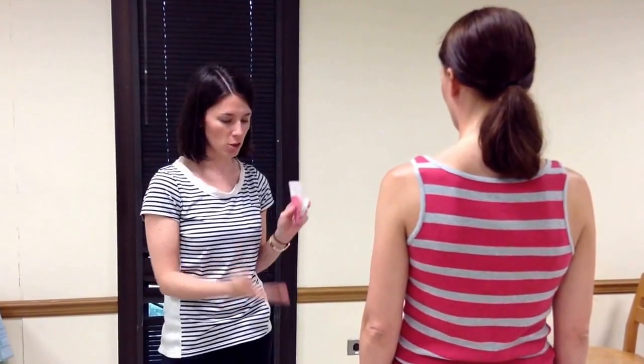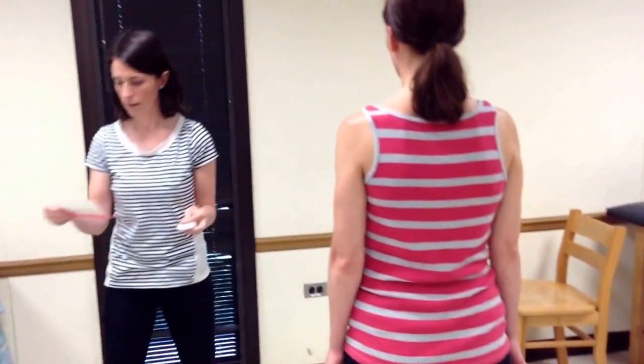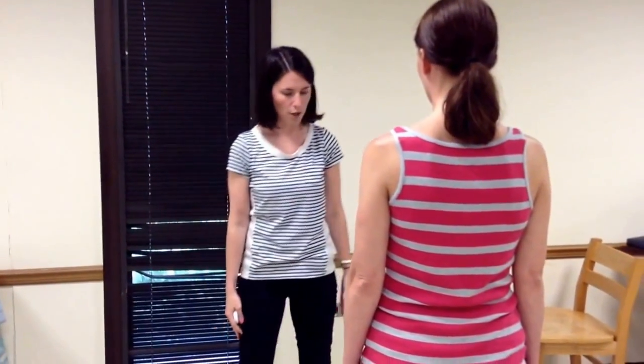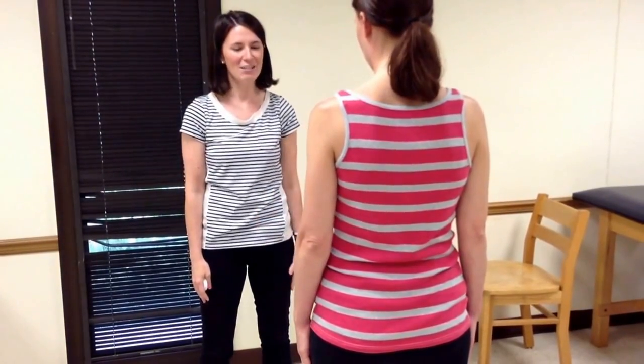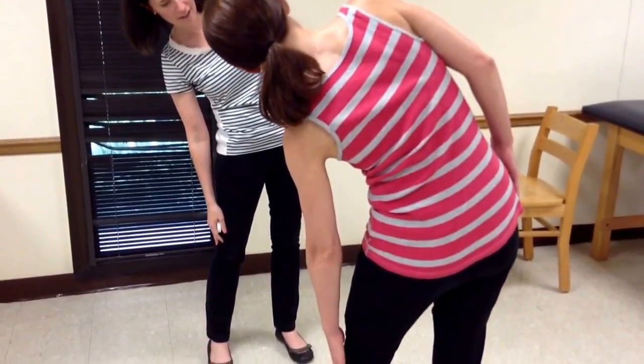The patient should be standing with her shoes off, her feet shoulder width apart. The instructions are: I want you to slide — we'll go to the left — so I'm going to have you slide your left hand down your leg like this as far as you can. And come on back up.